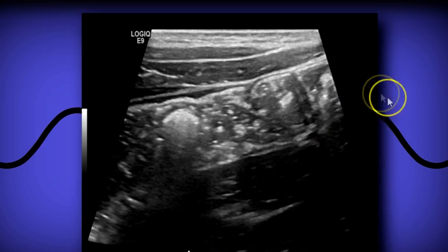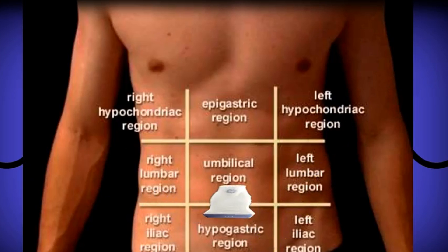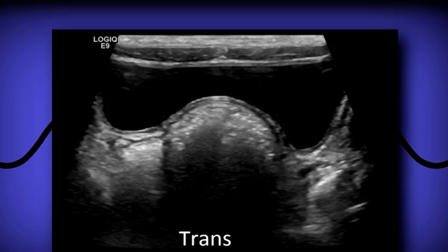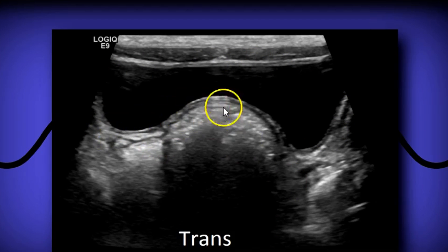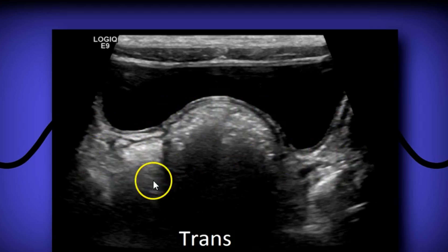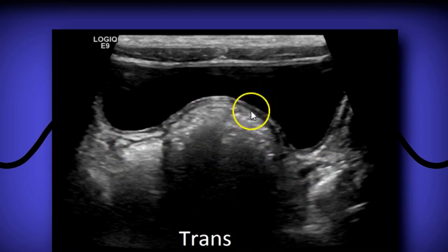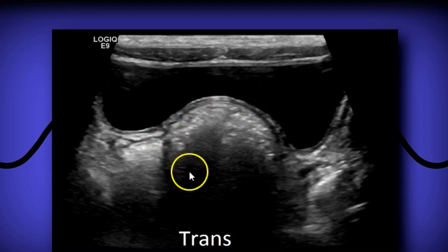More inferiorly in this patient you will find the appendix. Moving into the hypogastric region, you have the bladder — this is a good view to rule out free fluid posterior to the bladder. If you have a ruptured appendix or a ruptured ovarian cyst you can have free fluid there; you could also have physiological free fluid there. You can also see there's a lot of stool in the rectum, as is the case with this patient.